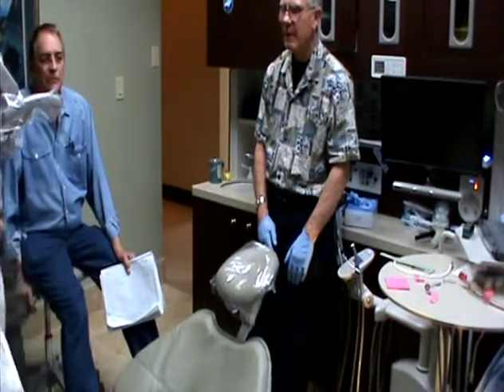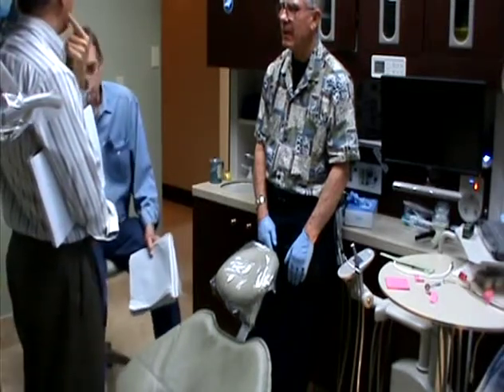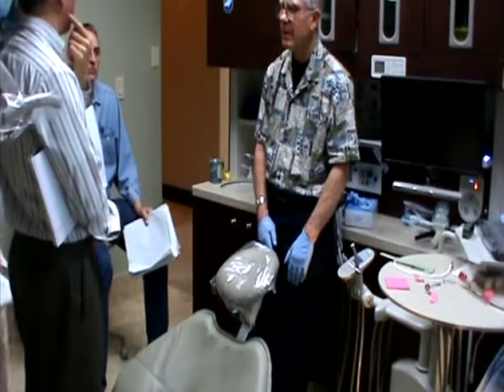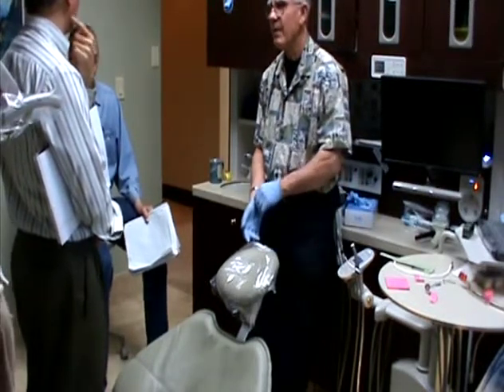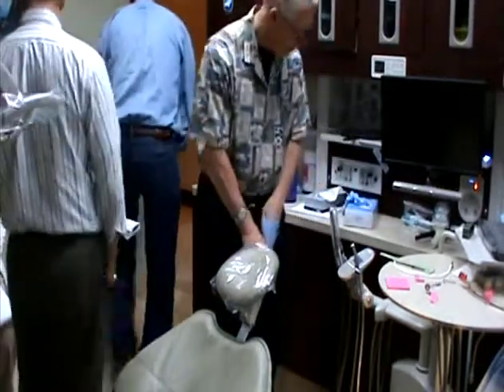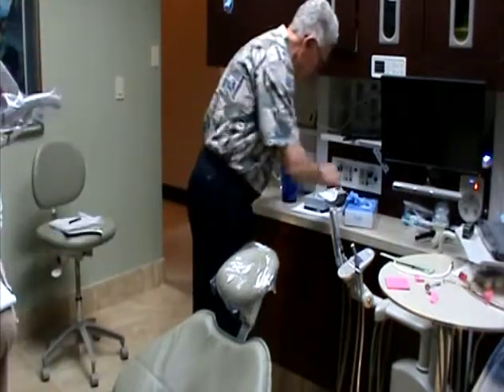Can you check me? I'm missing a second molar here, and this second molar is built up a lot. Just check me to see if this second molar needs to be cut down some, or if the lateral interference is driving my eye crazy. I know you checked the upper left side.